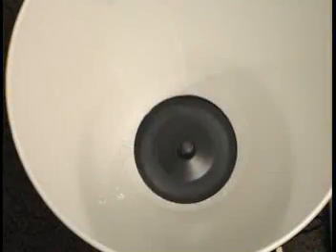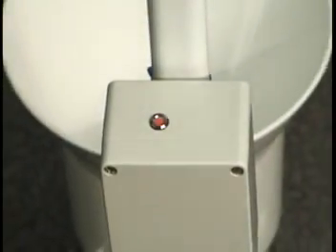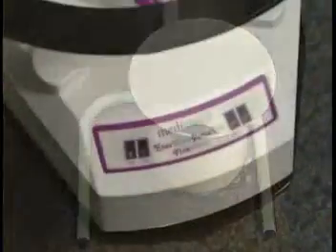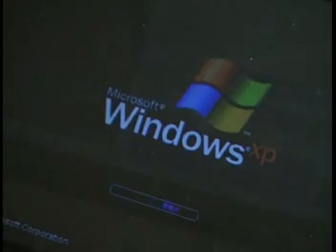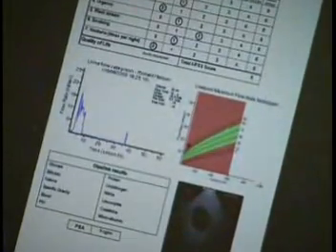Instead of the wireless weight cell flow meter, a wireless spinning disc flow meter may be used for recording. Key selling points for Portaflow Advanced are wireless connection to its flow meters, which can be either a wireless spinning disc flow meter or a wireless weight cell flow meter. It can be installed on any Windows-based PC, with automatic input into standard reports and letters, and linked to PSA Watch and ultrasound devices from MediWatch. It can also export data into Windows applications.